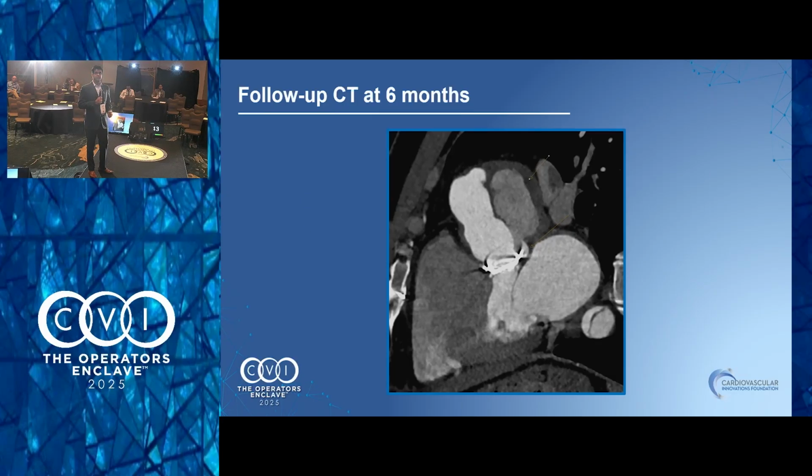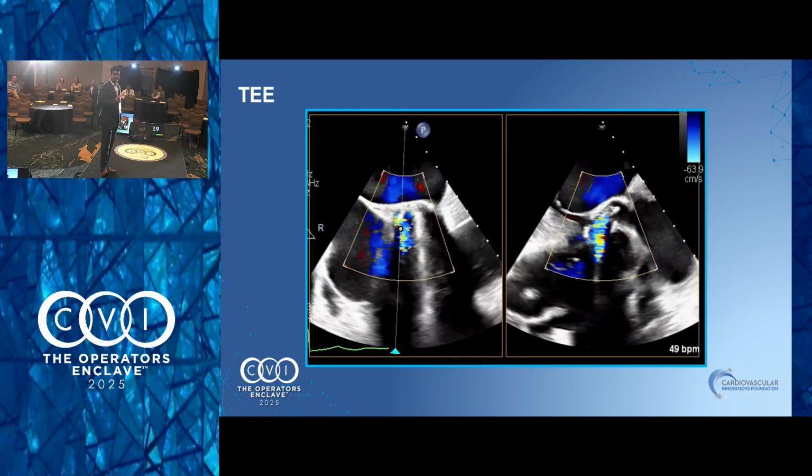I agree. It's going to continue growing. Once you start seeing all this pulsatile flow, it's not a small jet. It will continue to grow. There may be no way to access it from inside the aorta. It may be coming retrograde from the LVOT. So where would you go? Transseptal, or transapical? Then you have to go transapical. I think if it's LVOT, you could go transseptal. It's just quite the turn.